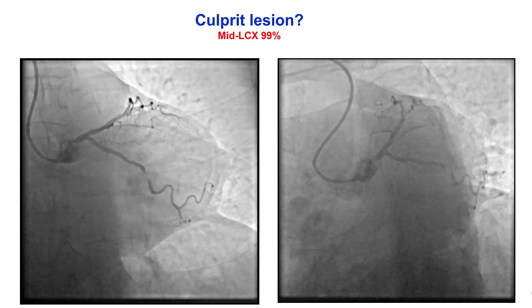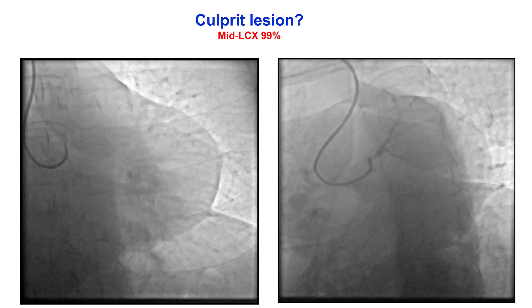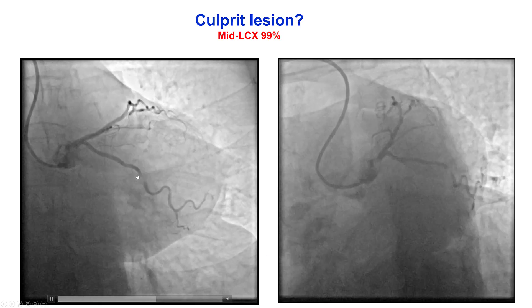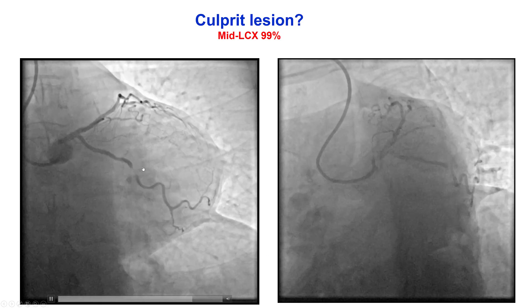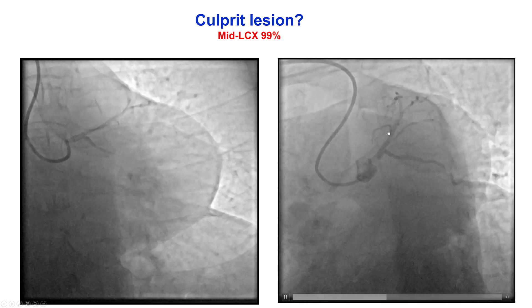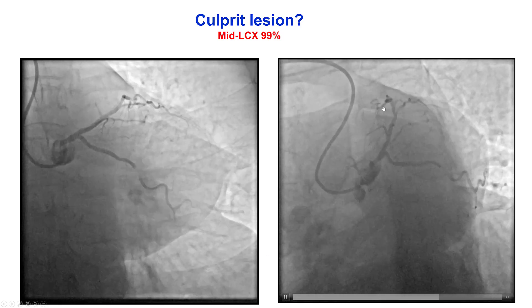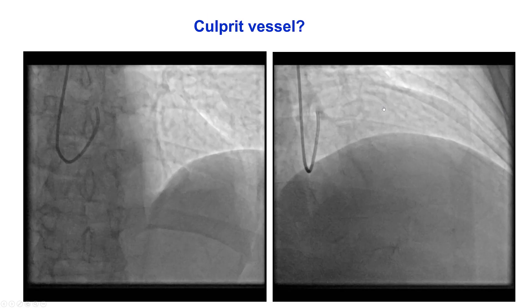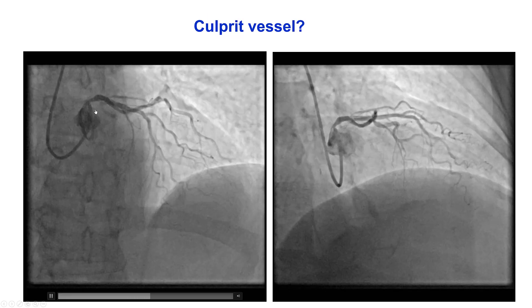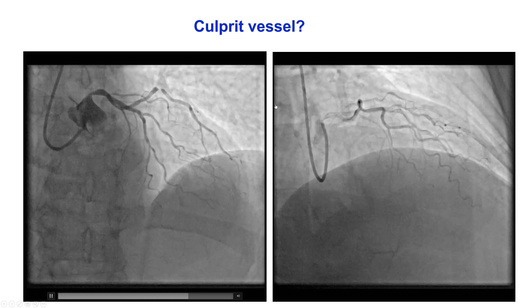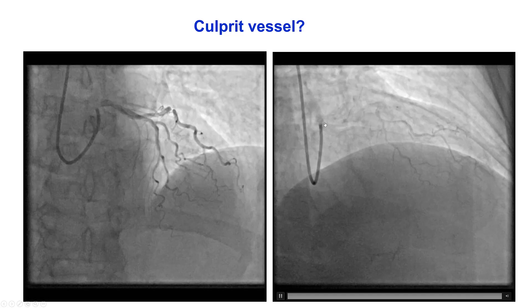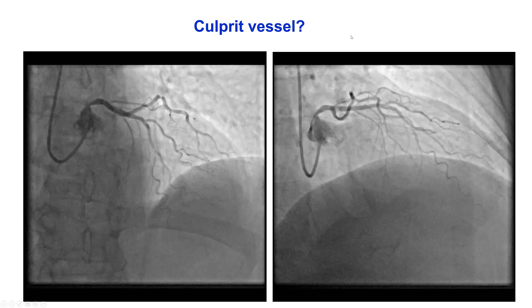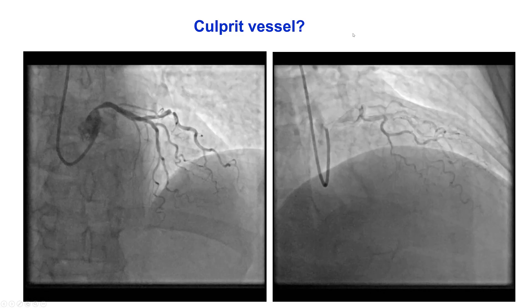Diagnostic coronary angiography demonstrated a severe lesion in the first obtuse marginal branch. There was no significant disease in the LAD or the right coronary artery. However, in different views, there appeared to be a lesion in the ostium of the left main.